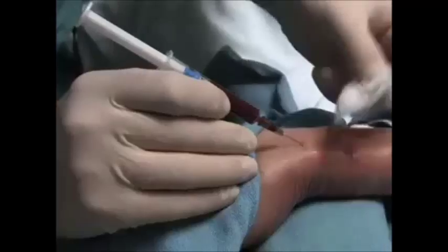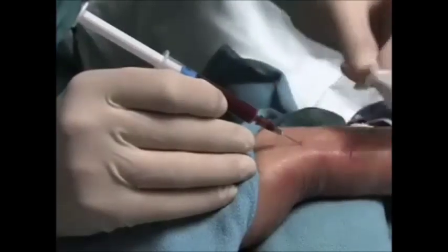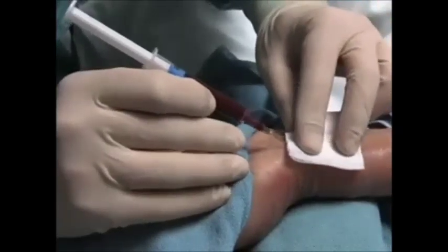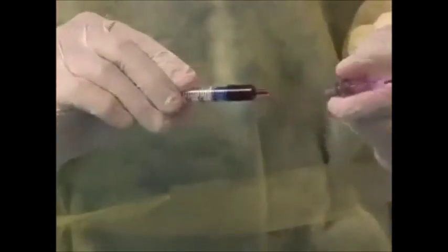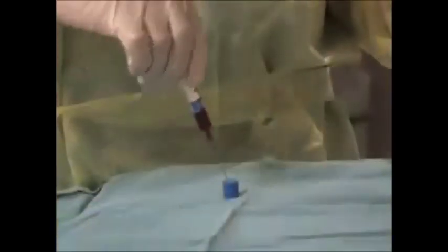After the blood sample is collected, withdraw the syringe and have an assistant apply pressure to the site with sterile gauze for approximately 5 minutes. In the meantime, expel the air bubbles from the syringe. Cover the needle with the attached safety cap and remove the needle from the syringe. Or remove the needle from the syringe using the rubber stopper.